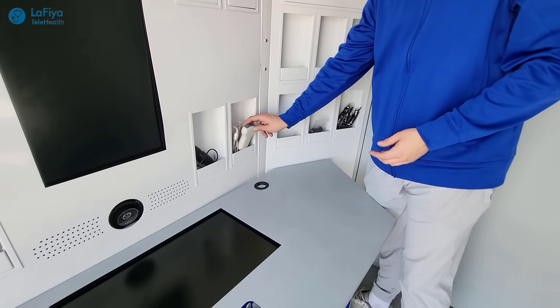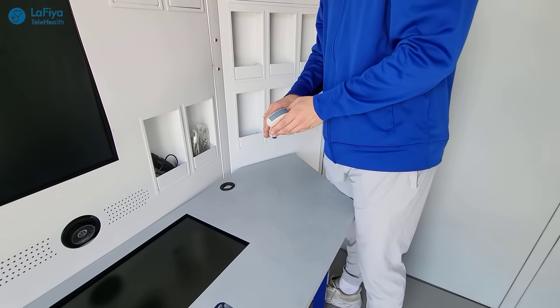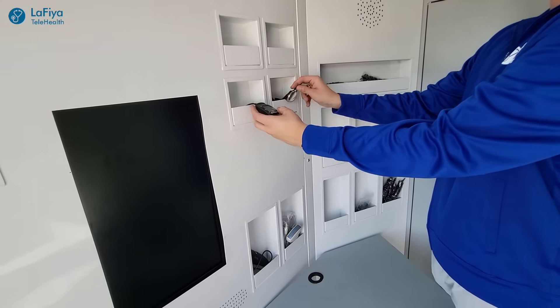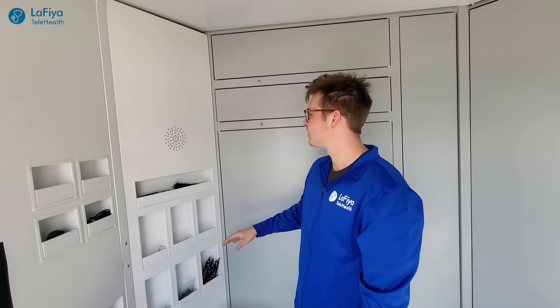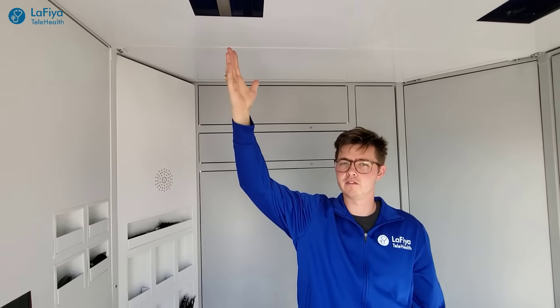The kiosk can do anything from an ultrasound — which can be hooked up to the system so the doctor can see what is going on — to taking your pulse, and even a stethoscope. The kiosk is also equipped with speakers and lights above that will brighten the area so that the doctor can clearly see the patient.